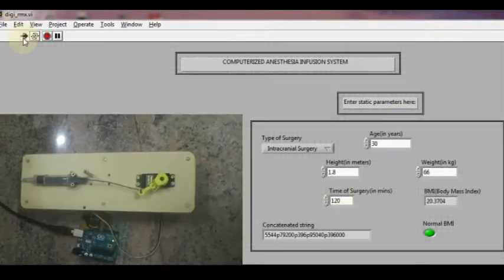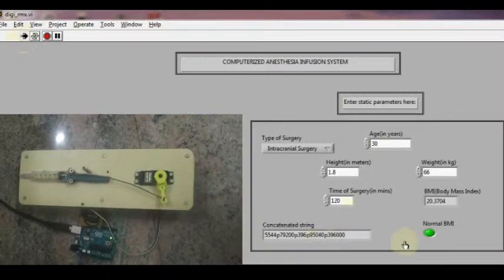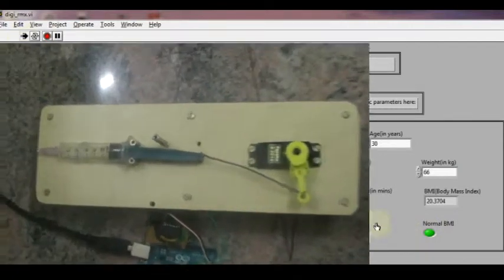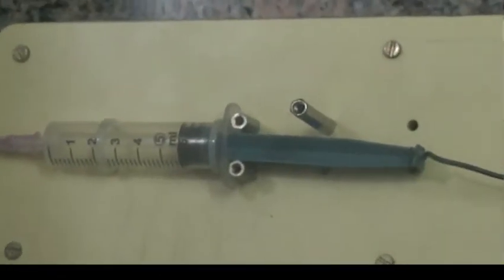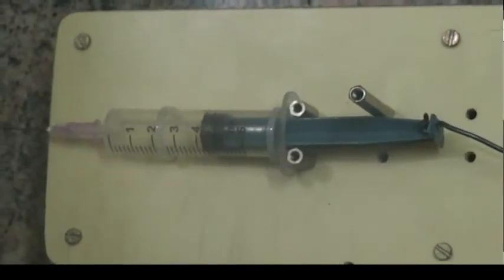The system calculates the dosage based on the BMI, duration and type of surgery. These dosages are transmitted to a microcontroller over a VISA interface. Once the syringe has been loaded, depending upon the calculated induction dosage, the syringe is actuated using the controllers.